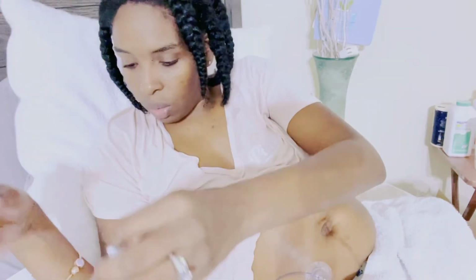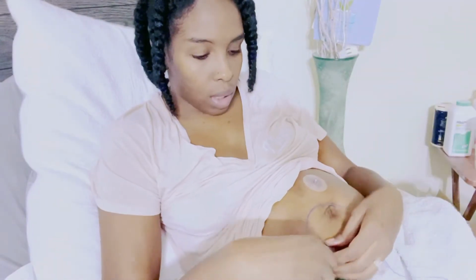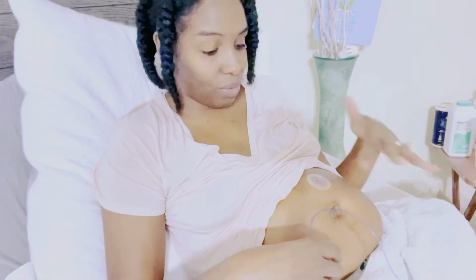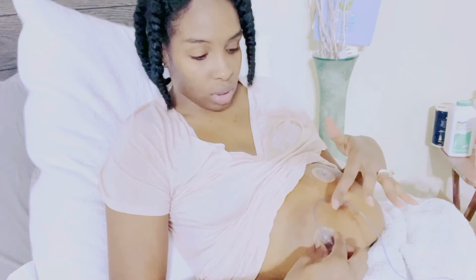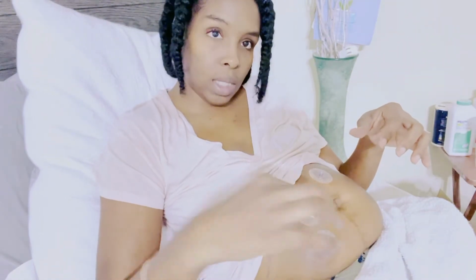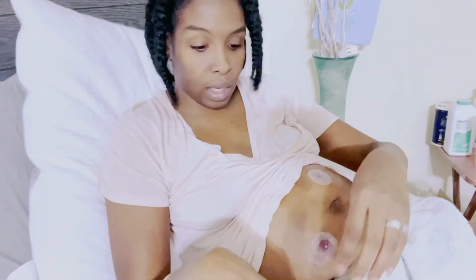All right, so now I take this part. And actually, I usually take this off all the way first. I got carried away with the video trying to get the needle stick out of the way that I forgot to take this off. But I usually take this off first. I don't keep both in at the same time. So you just push on the sides here and unclamp. See, this could come off and on. You clamp and unclamp this piece.